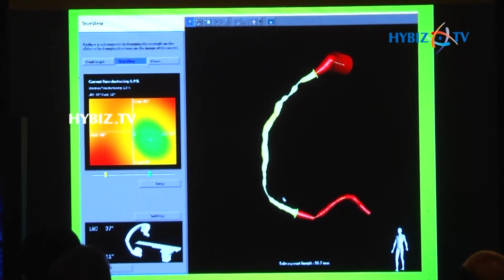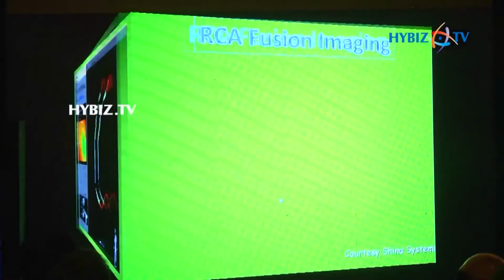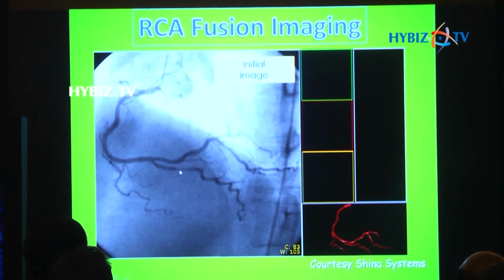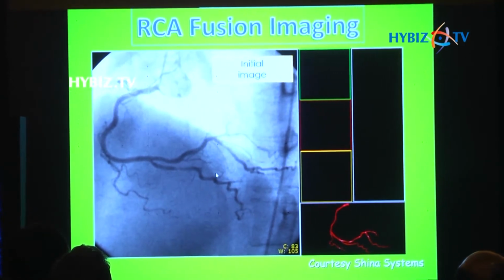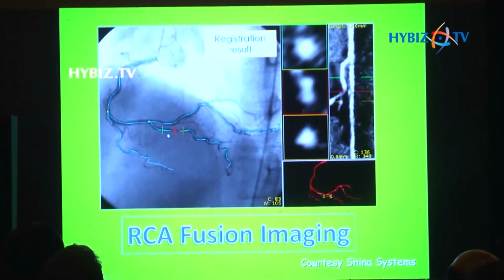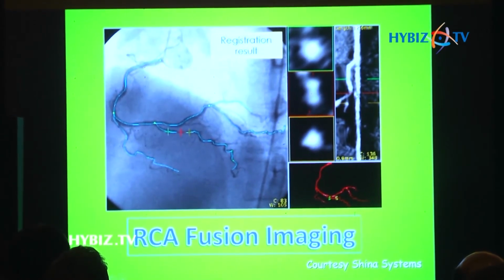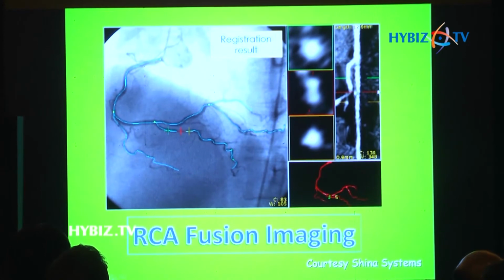And you get the whole artery splayed out. And you can also see the best views. So this is the angiogram of the same patient. This is a totally occluded segment. Then we superimpose the CT pictures on that. The red cross is the point where we find that there's a complete CTO, and that is shown here on the CT angiogram right here.